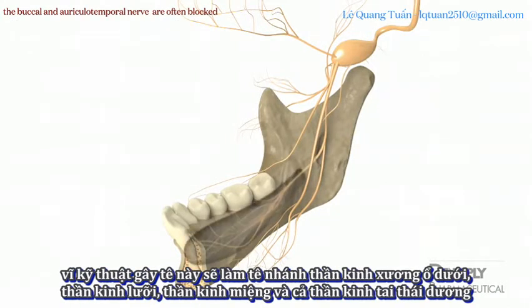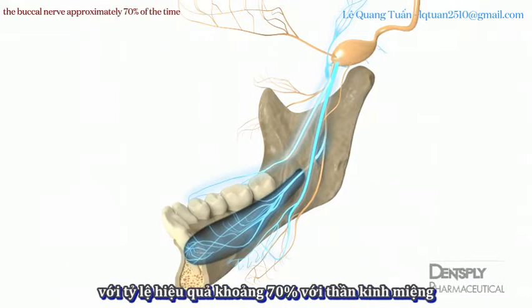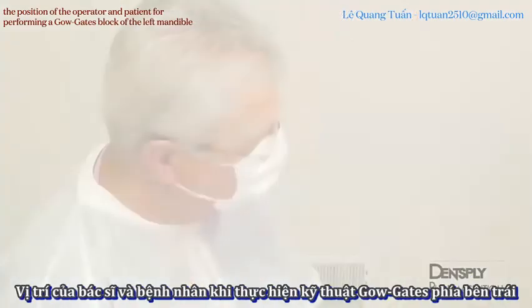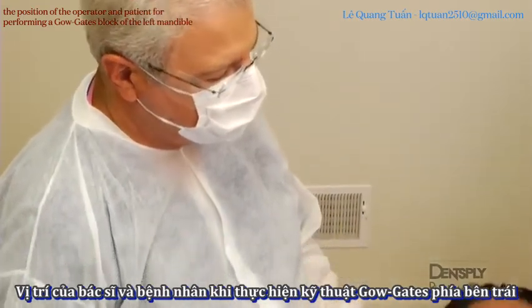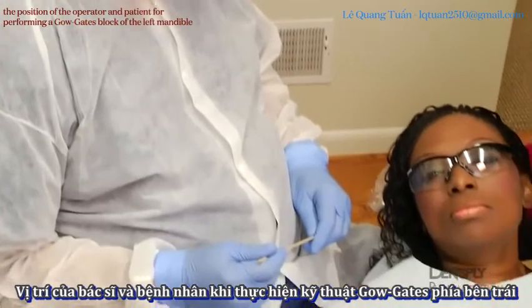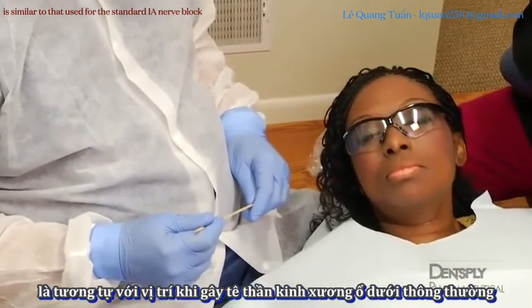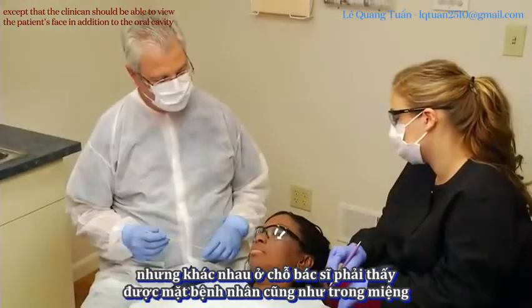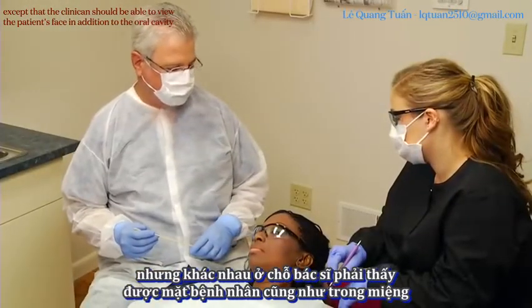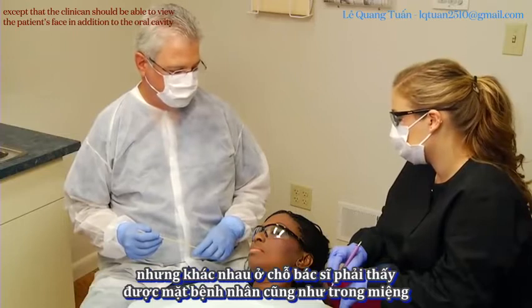In addition to the inferior alveolar and lingual nerves, the buccal and auriculotemporal nerves are often blocked, the buccal nerve approximately 70% of the time. The position of the operator and patient for performing a Gowgates block of the left mandible is similar to that used for the standard inferior alveolar nerve block, except that the clinician must be able to view the patient's face, in addition to the oral cavity.